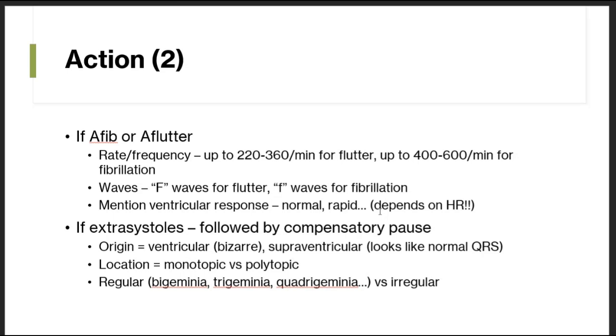Anything around the 1000 to 1500 mark is most probably not due to any electrical activity of the heart, but rather some electrical excitation of the skeletal muscles, because even pathologically, the heart cannot conduct or beat that fast.